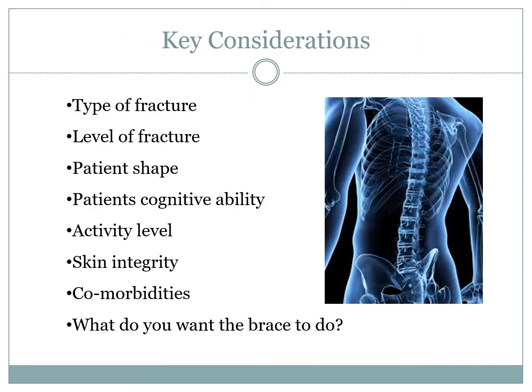The key considerations when deciding on a spinal brace are the type of fracture, the level of fracture, the person's shape, a person's cognitive ability, a person's activity level, their skin integrity, comorbidities, and the reason for the brace.